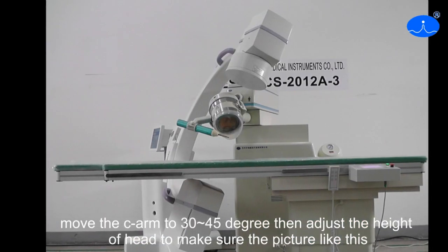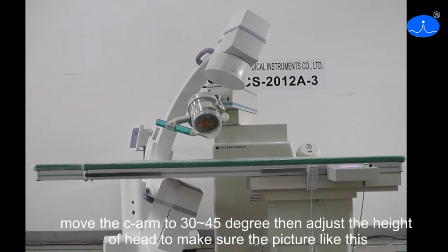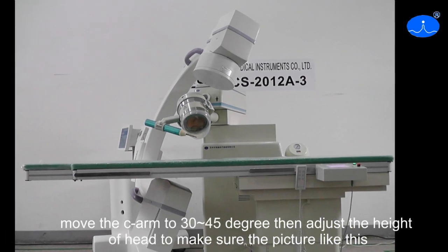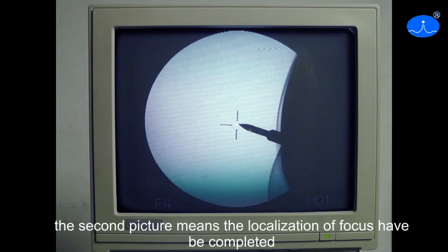Move the C-Arms to 30 to 45 degrees, then adjust the height of the head to make sure the picture looks like this. The second picture means the localization of focus has been completed.